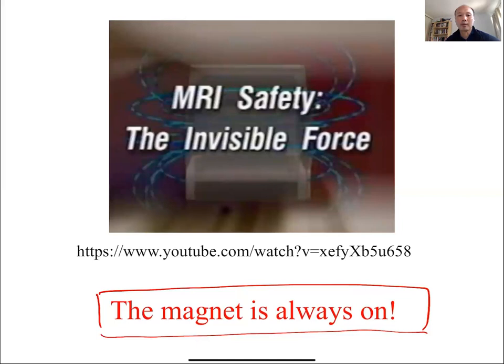All right. Most of you will probably have an MRI in your lifetime or work around an MRI, so just make sure you realize the magnet is always on. Okay. So it is always quite dangerous. And you should never bring anything ferromagnetic into the field. And likewise, if you happen to be lying in the magnet and see someone bringing something in, you need to tell them to stop immediately. Okay.